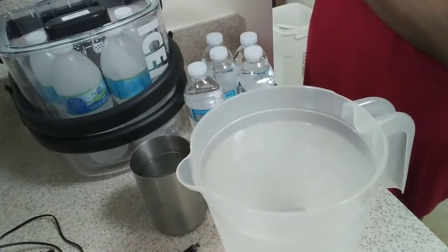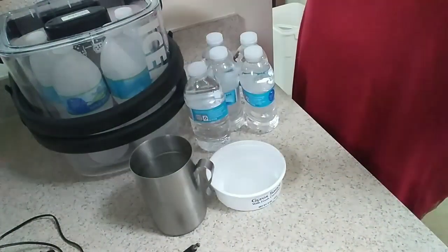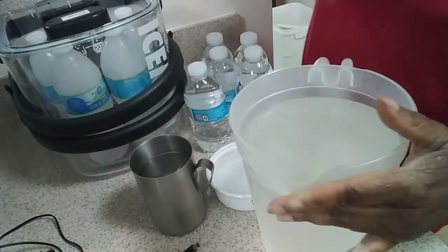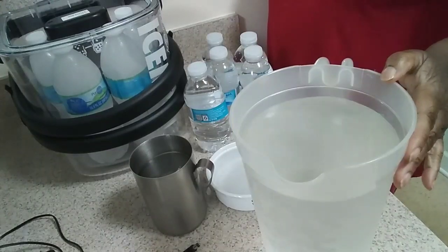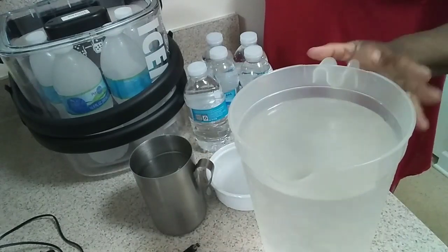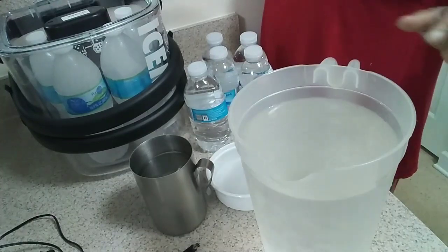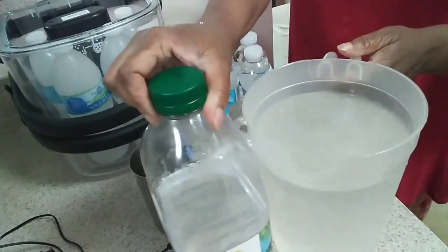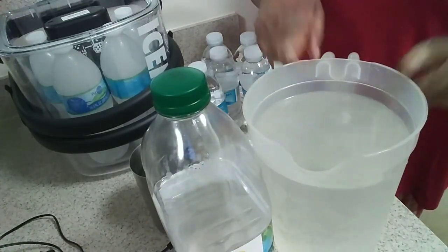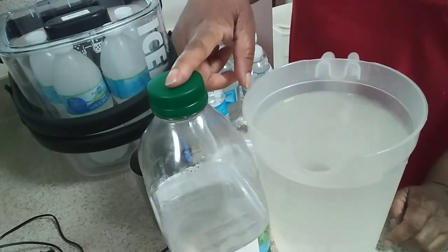I just wanted to drop this tip off to you guys. This is a 72-ounce pitcher, and I ended up using maybe half of it. I don't know if you could find something big enough to hold all the water at once, but just break it up however you want. This is how I did it — I use this pitcher to make the water cold, as well as the frozen bottles, because whatever the bottles leave off, I can get the rest of the cold water out of the pitcher.